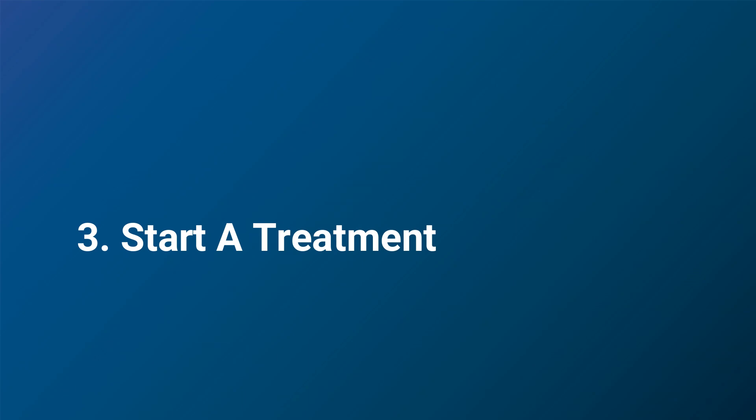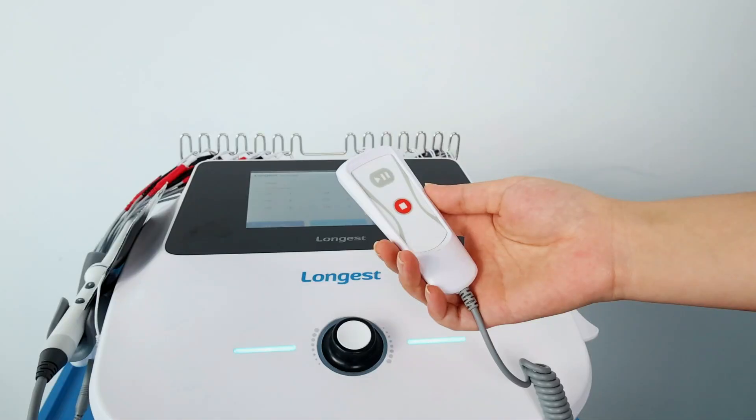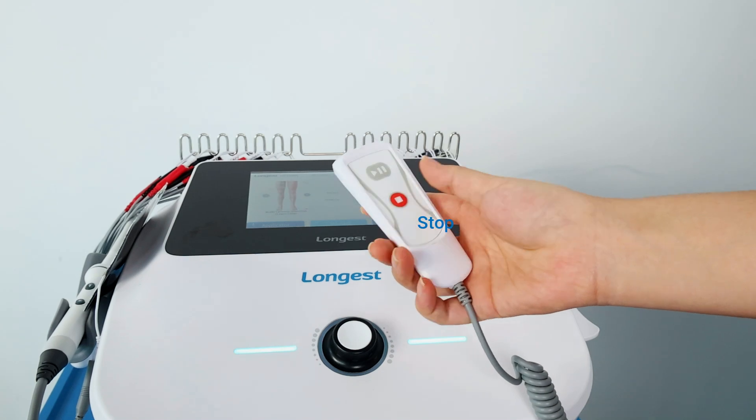Now set a protocol to start a treatment. Before use, check if the hand switch works normally.